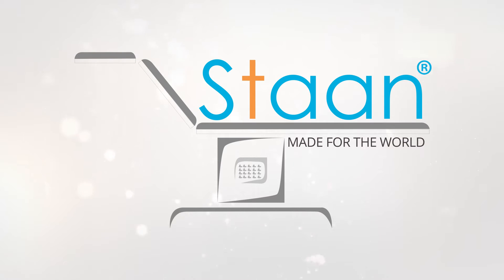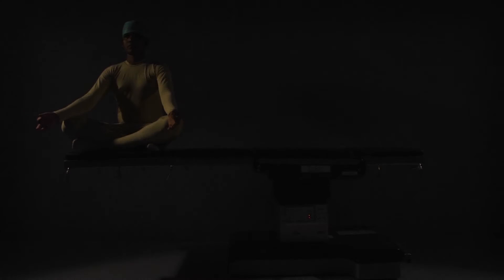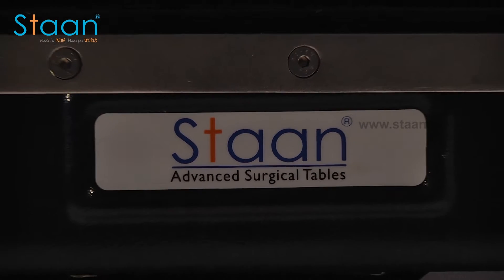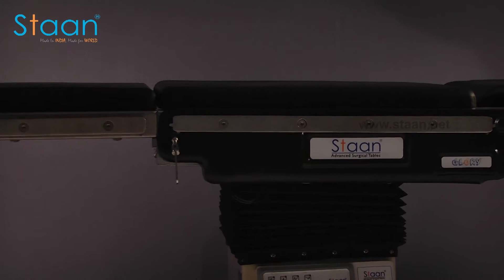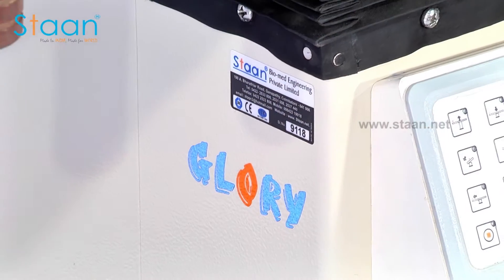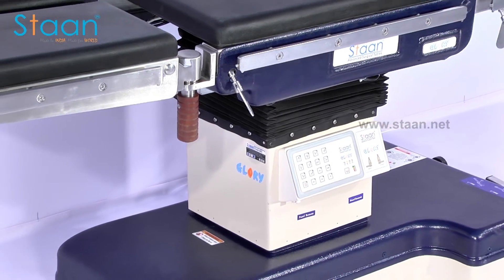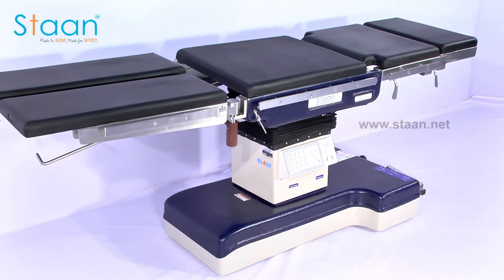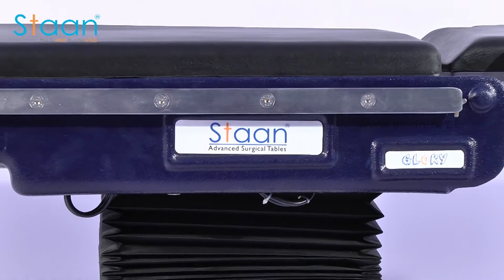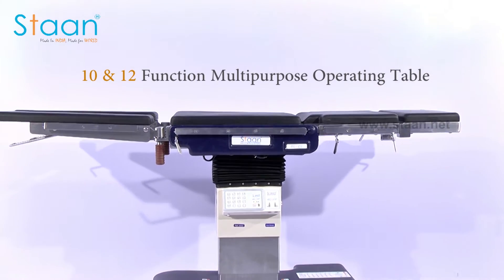Stan, made for the world. Welcome to Stan Advanced Surgical Tables. We feel proud to introduce our product Glory. Glory is a world-class 10 and 12 function multi-purpose operating table designed by Stan.